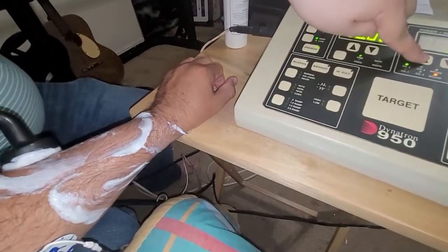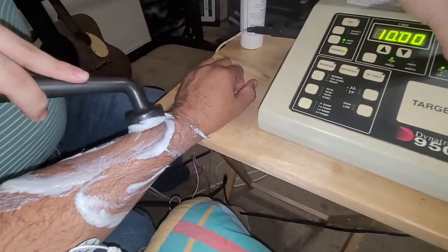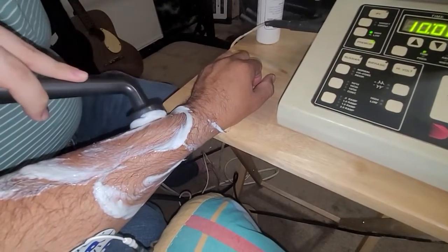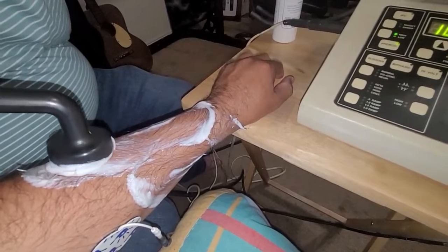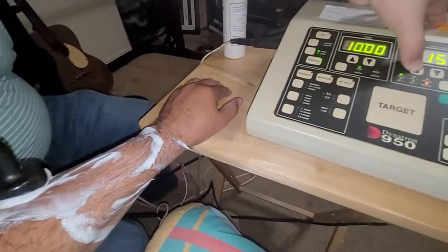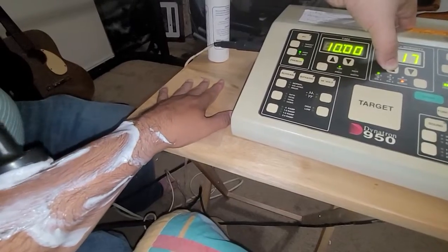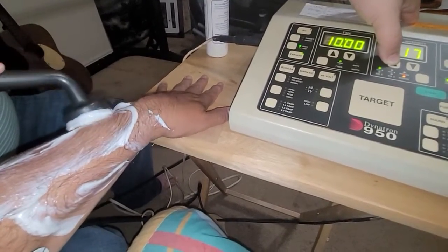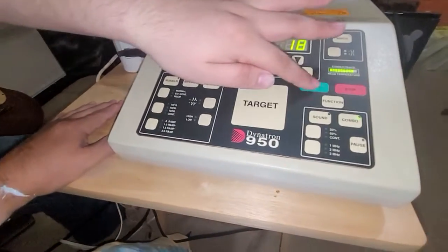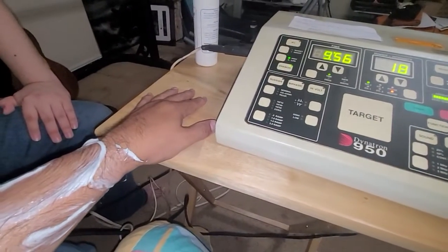I'm starting to feel a tingling in the forearm at the electrode. Keep going, and you'll see movement in the fingers in a bit. We're at 10, 10.5, 11, 11.5, 12, 12.5. I feel the fingers tingling. We're going to keep going until you see the fingers move. Now they're moving. Keep going a little more. 18. Okay, so now it's working there. Now hit the start button. Once you set that, hit the start button. And now we're running.